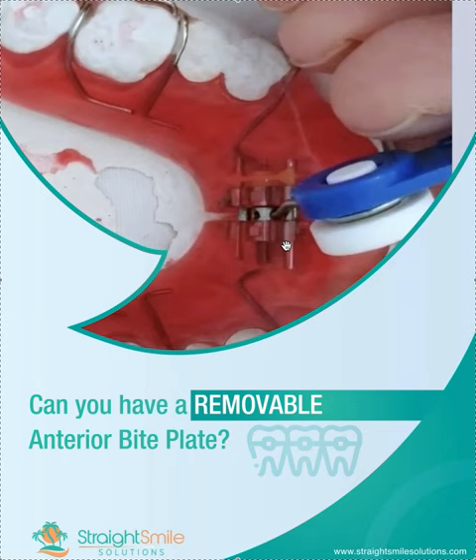So yes, you could have just a removable anterior bite plate, or a removable anterior bite plate Schwartz expansion device — all you have to do is ask the lab to stack the acrylic. My suggestion is you always send an opposing model or scan. Thanks so much.